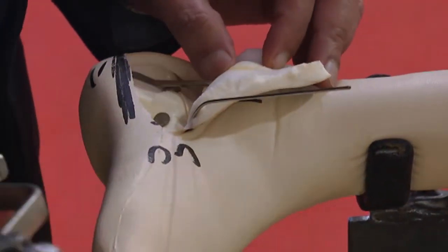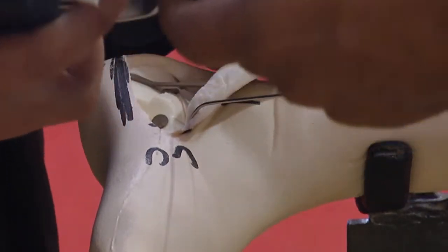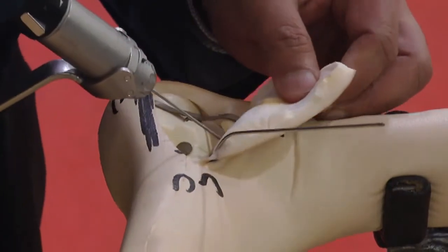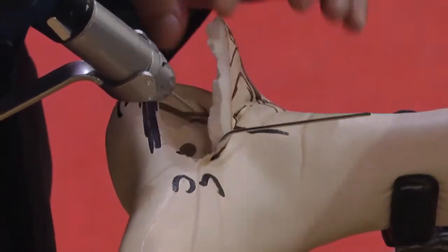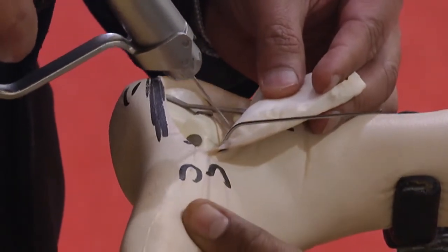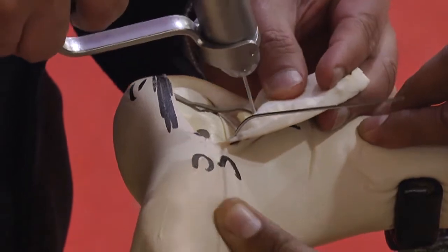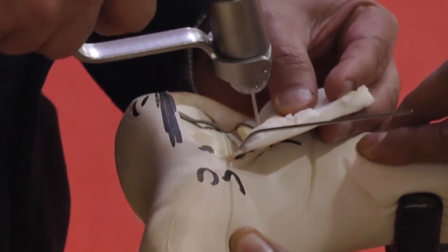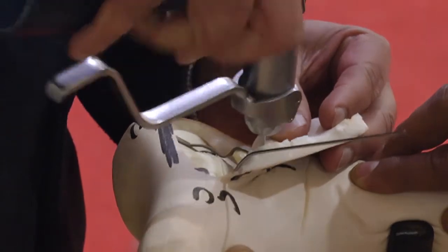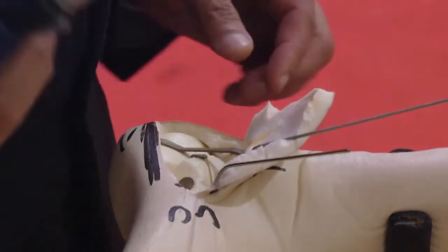Then we put a second K wire, which goes anterior to the neck of the talus. Obviously you do not expose it. Here the bone is seen, but you have not exposed anything in this area, so it is just by feeling the fibula, sliding just anterior to the fibula, just by the feel of it, and you put this second K wire and then bend it with the drill itself.